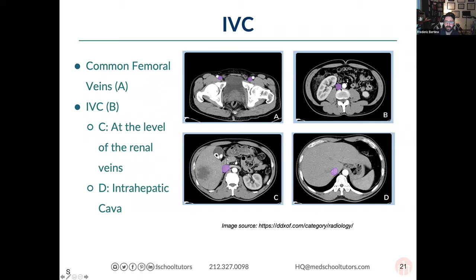In image B, the IVC is to the right of the aorta — veins tend to be right-sided structures while arteries tend to be left-sided. The aorta is left-sided because the left ventricle is the systemic ventricle; blood return goes to the right atrium, so our largest veins tend to be right-sided. In image C, the renal veins are shown entering the IVC. Image D shows the intrahepatic IVC before it crosses the diaphragm at the hiatus and enters the right atrium at the inferior cava-atrial junction.